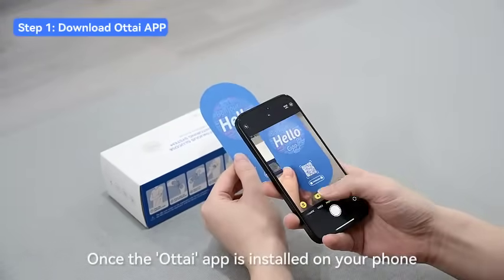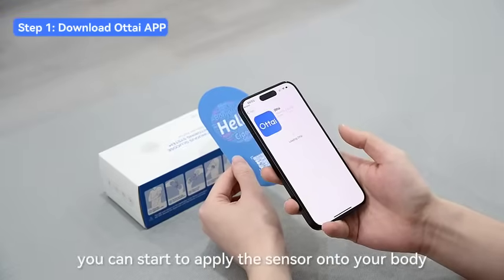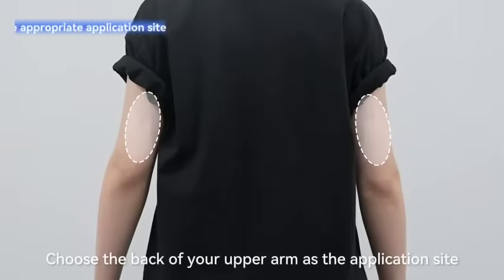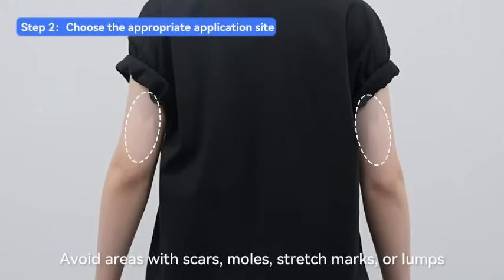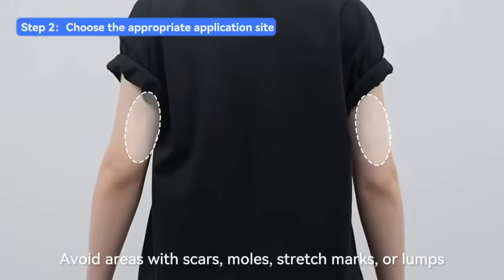Once the Otai app is installed on your phone, you can start to apply the sensor onto your body. Choose the back of your upper arm as the application site. Avoid areas with scars, moles, stretch marks, or lumps.